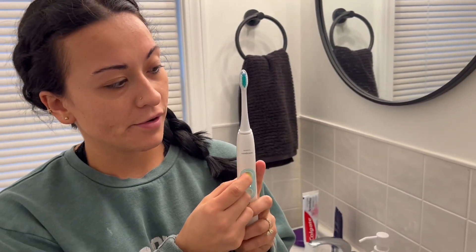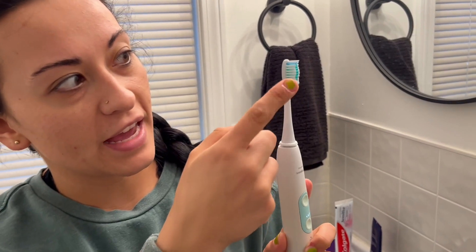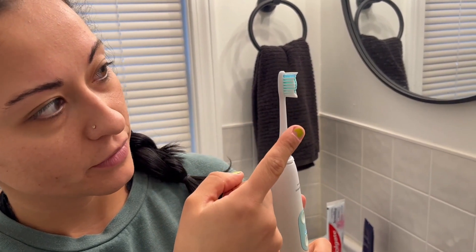So I'm just going to turn it on. And you'll see that the head is vibrating, which is great, and it's super tough on plaque as well.